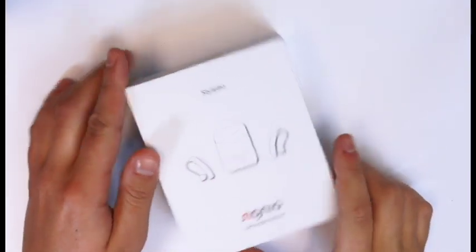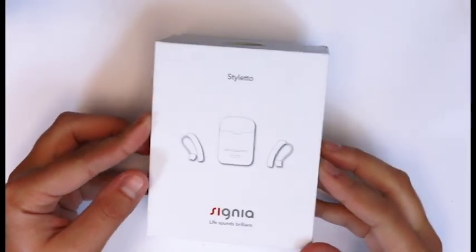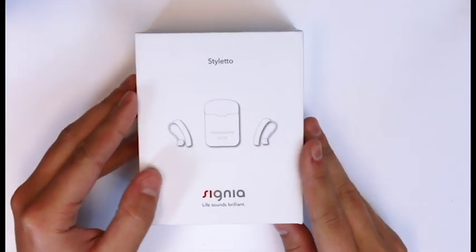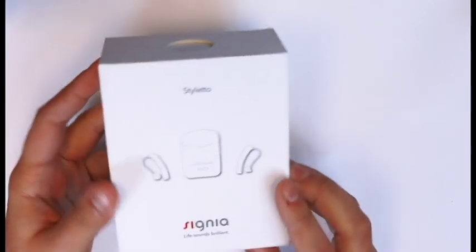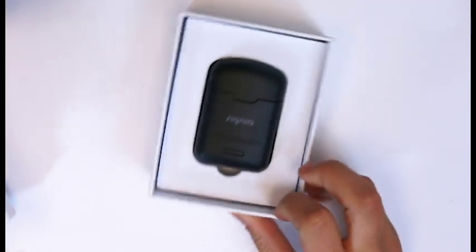This is Michelle from My Hearing Centers, introducing the new Styletto from Signia. This is their latest product in the NX line — we've got that nice fast processing chip, the own voice processing, and all of those nice things. But what they've really done here is some nice style changes to kind of update the product.